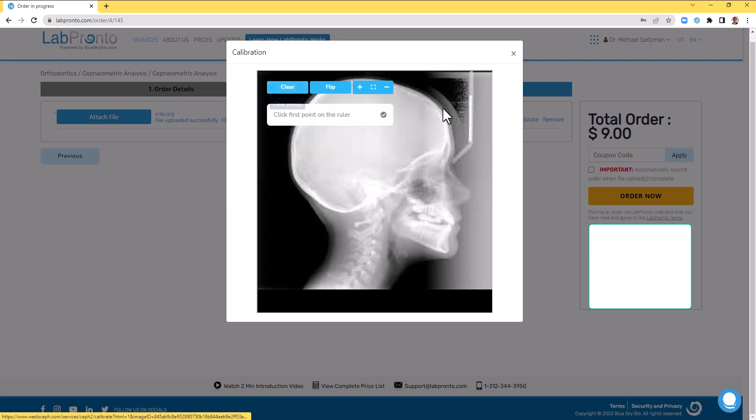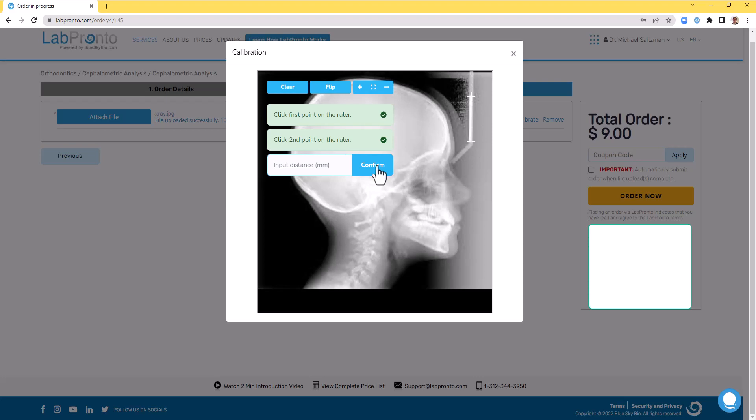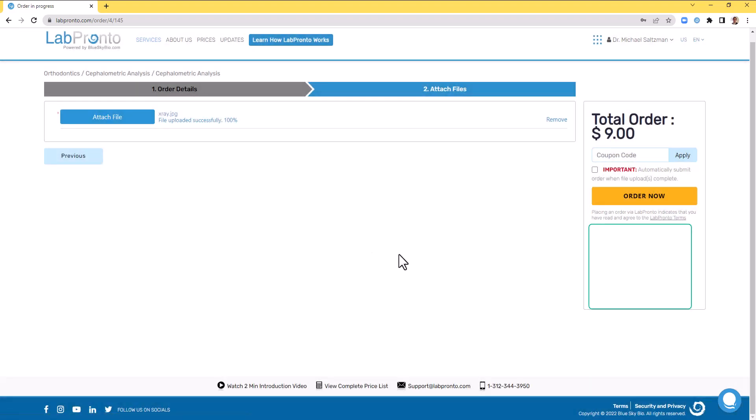Calibrating just takes a second. Click to start and click once at the start point. Click again at the end point and enter the relevant distance. Then click confirm. You have now calibrated the image and press the order now button to place the order.